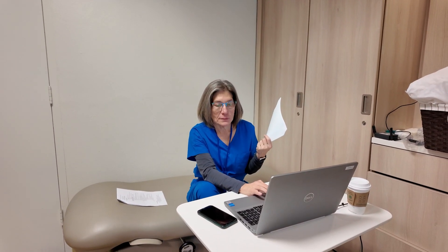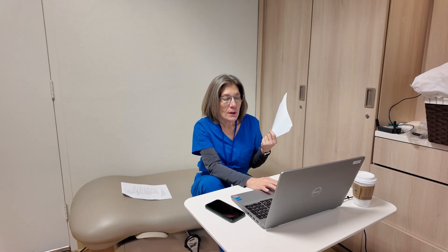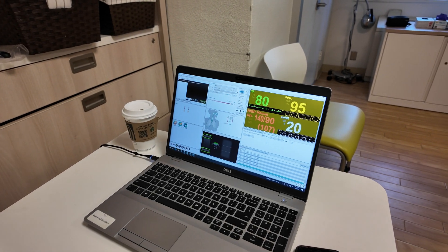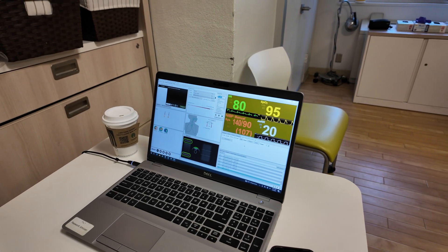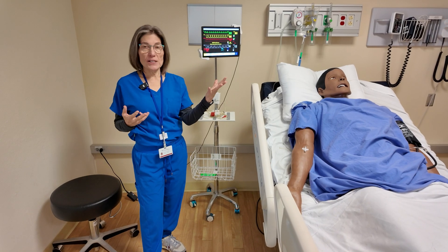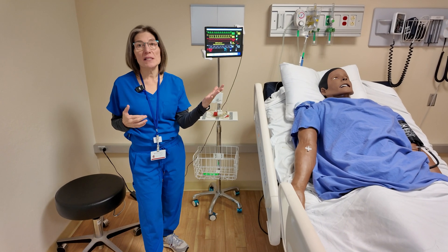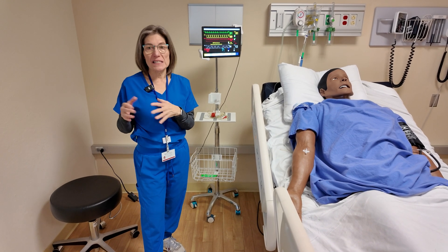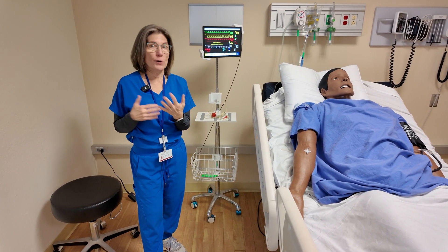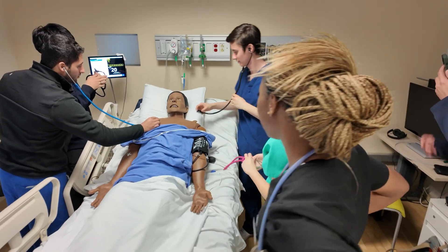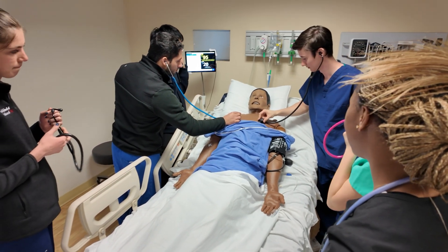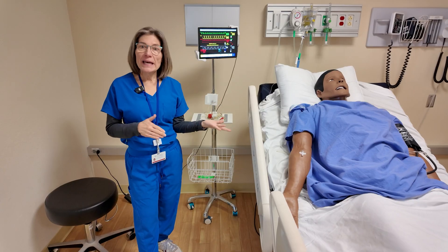All of our simulators get hooked up to a computer. We pre-program a variety of clinical scenarios for the students' benefit, and that really helps us with the educational process because it ensures that they can see a variety of different clinical situations that they might not have the ability to see in the hospital. It's very random in the hospital.